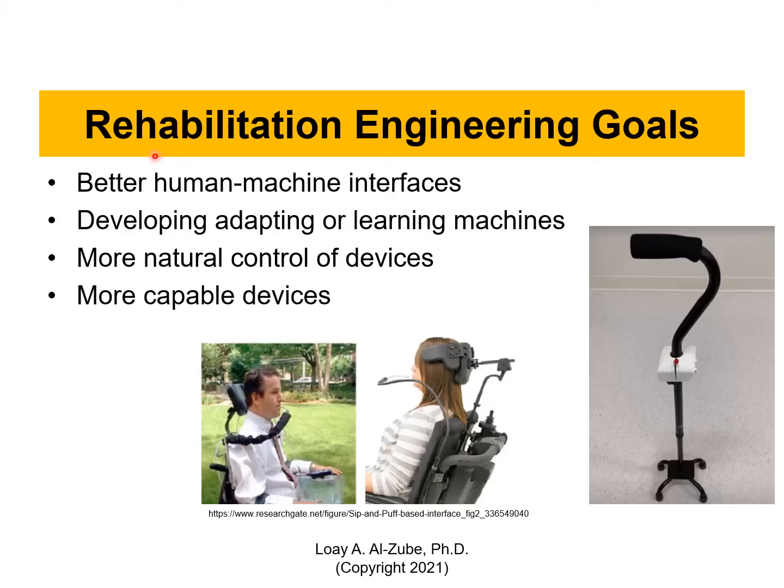I'm not here to teach you how to do a passive prosthetic leg or arm, a cosmetic one. We're here to do things called active prostheses. That's interaction between a human and machine. Automation is coming, we better be part of it.